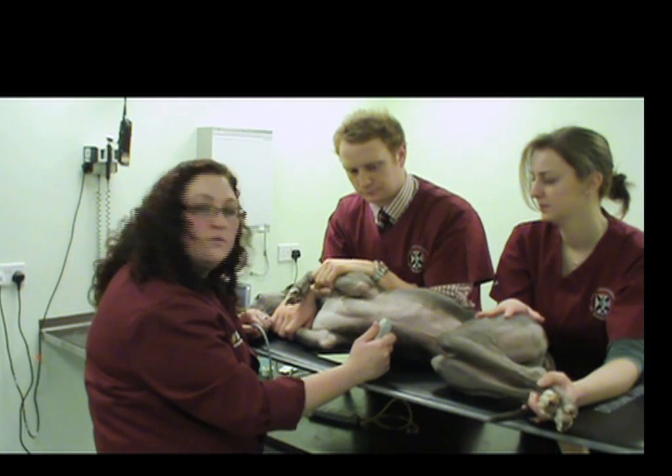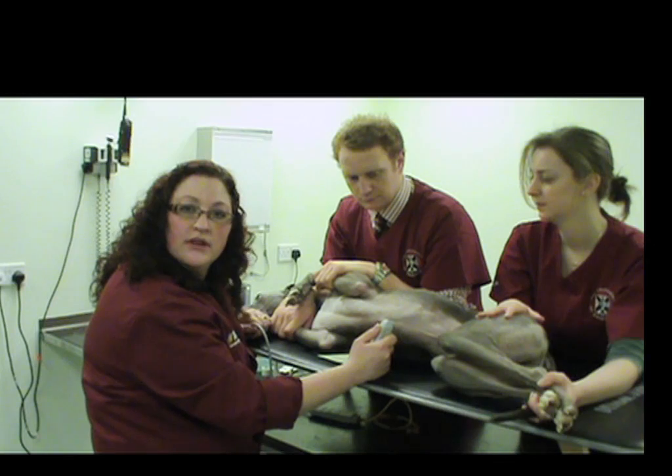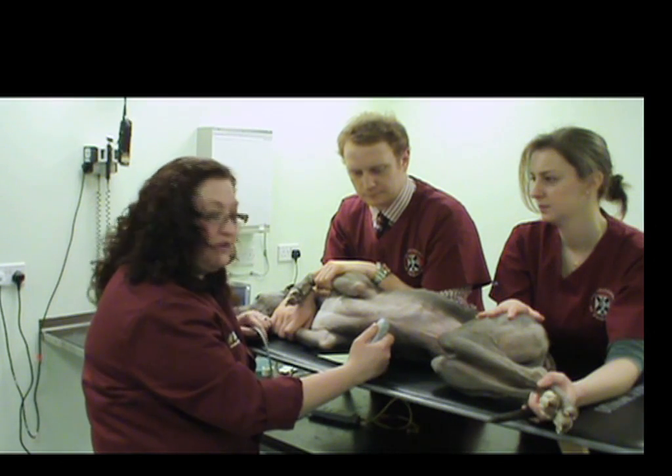So now we're ready to get started. What we will now do is just take a quick recap and look at what we need to change on the ultrasound machine and also how to hold the probe in order to optimize the quality of our images throughout the entirety of the ECHO exam.